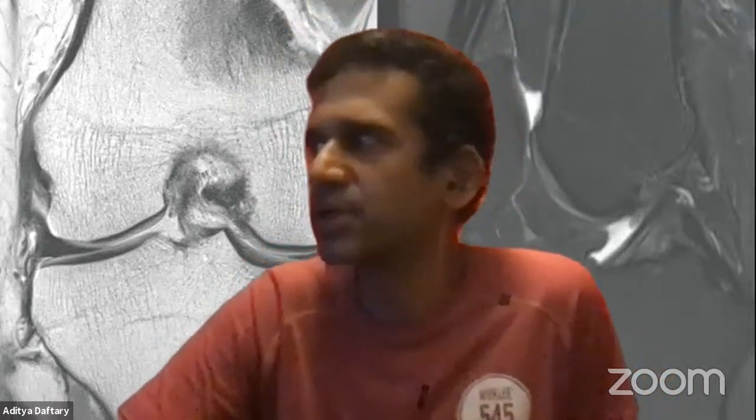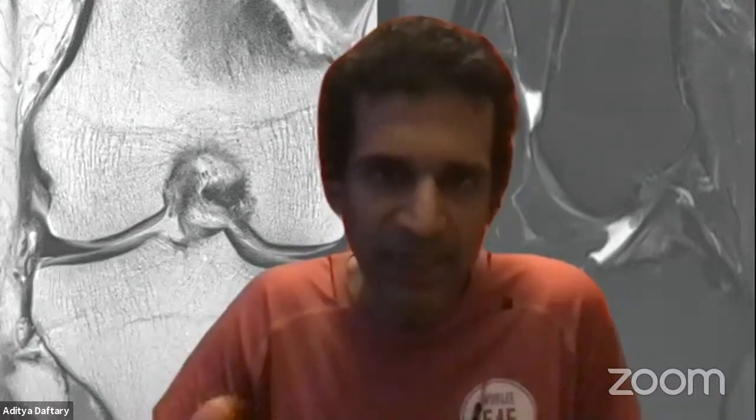It's completely different. Essentially, the old school was that we used to do T1 weighted images because the original studies were done using T1 weighted images. But today we use fast spin echo proton density images. Essentially, we can get much more information, and they are as diagnostic. So yes, we don't need T1 weighted images. The only time we really need them is when we're looking at tumors and infection.